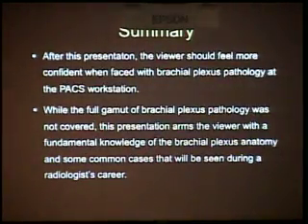So that was a whirlwind tour. I know that's a lot of information, but I try to spend more time on the anatomy and the normal stuff, because if you know what normal looks like, you're going to be able to interpret these cases a lot better. So your nerve bundles on T1 are going to be iso-intense to the scalene musculature, which you're following as a landmark. Compare that, and then compare the two sides. And then just follow the nerve as far as you can and all the way back to the cord.